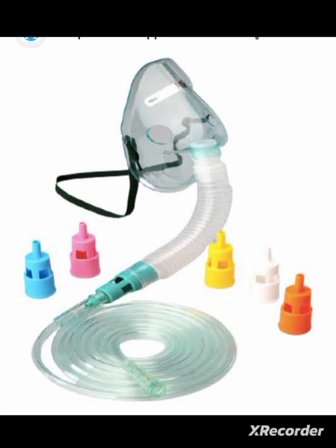So these are all the methods of oxygen administration: low flow delivery devices and high flow delivery devices. Low flow delivery devices are nasal cannula, simple face mask, partial rebreather mask, non-rebreather mask, oxygen conserving cannula, transtracheal catheter, face tent, tracheostomy collar, tracheostomy T-bar. But in high flow delivery devices, only one thing, that is the Venturi mask, and it has cone shaped devices that help to deliver O2 concentration accurately and precisely in different ways.